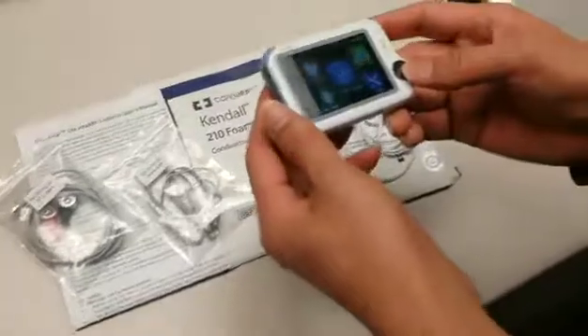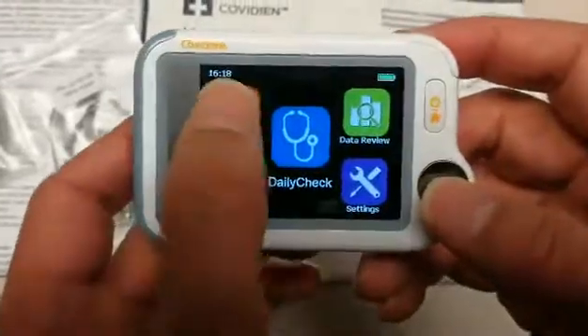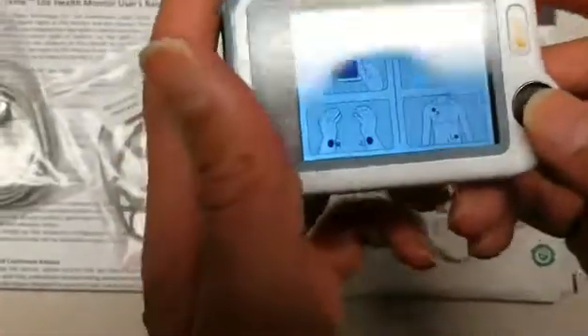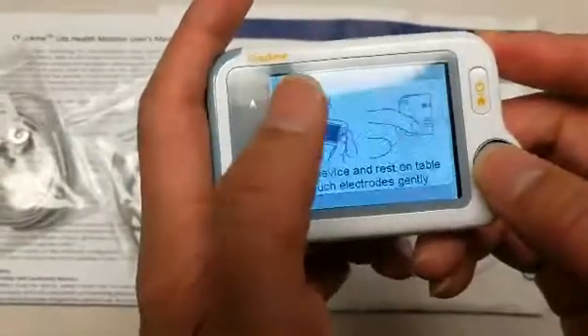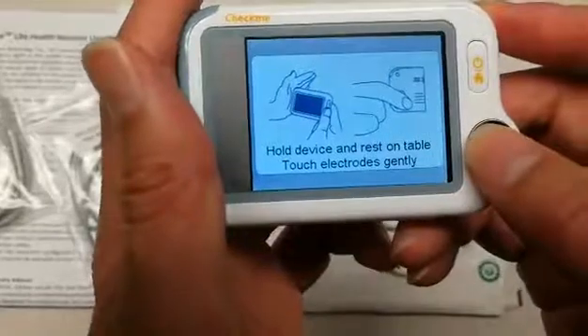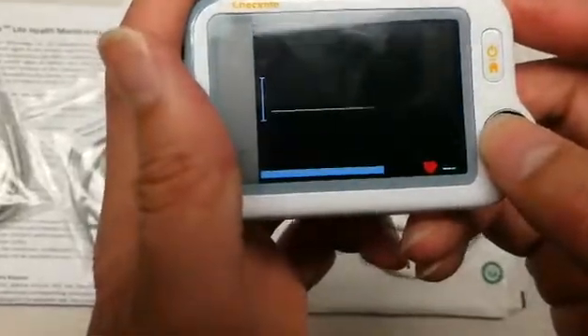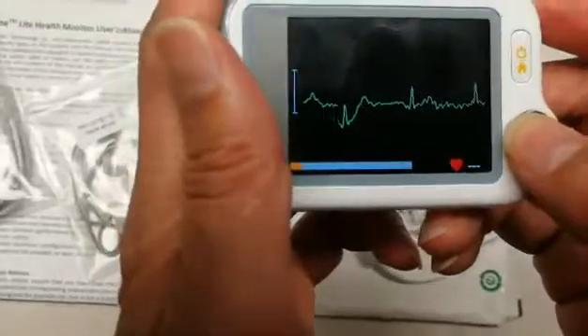With the device turned on you will see several menu options. The ECG recorder will allow you to choose an ECG type to give you a reading. Please make sure to cover the electrode pads as signaled on the device, at which point it will begin to give a reading of your ECG levels.